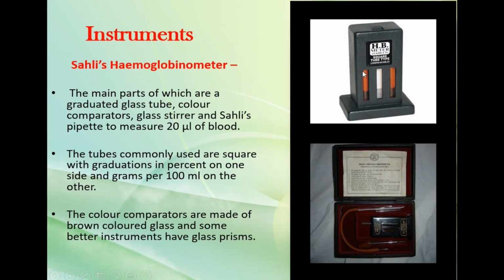You see, this is the reference one. You will always see the color on the reference block, right? So when the sample matches this color, this color represents the level of hemoglobin, and these tubes have the scale. We already know this, right? I don't need to explain more. So all of you know this, right?